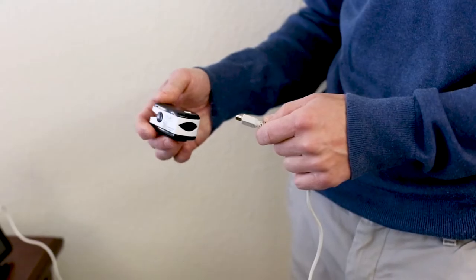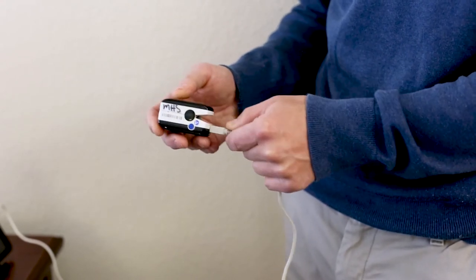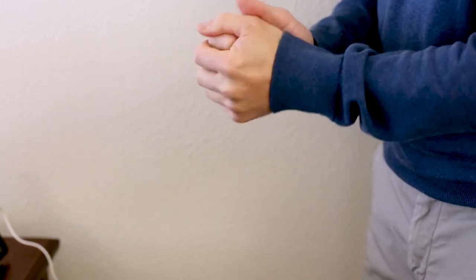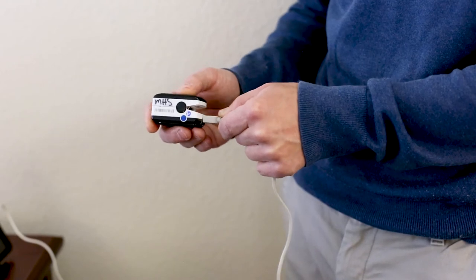The pulse oximeter finger probe should also remain plugged in at all times. Please be sure your hands are warm and dry prior to turning the probe on. Press the gray button to turn the device on.